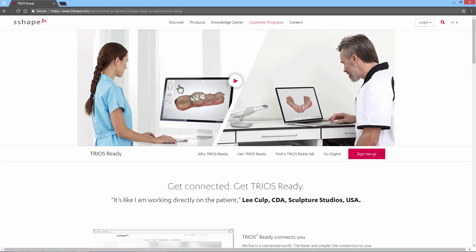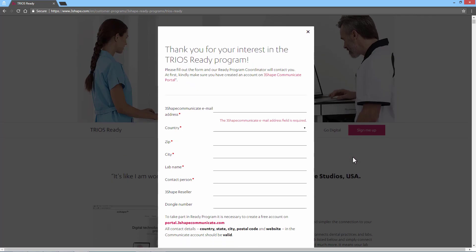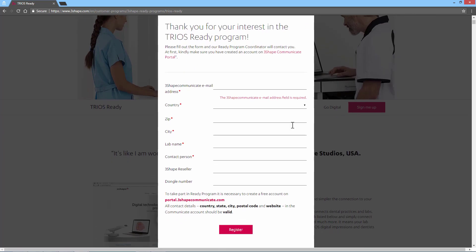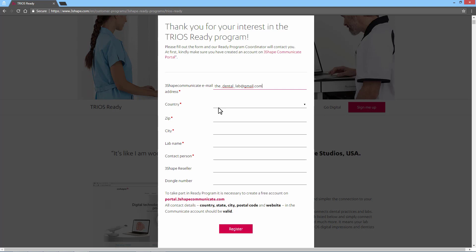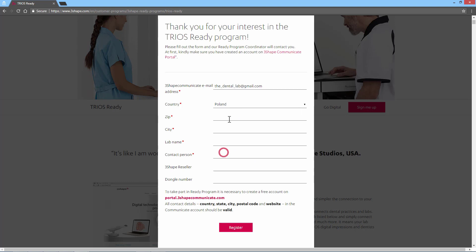To sign up for the TRIOS Ready program, click the Sign Me Up button. Then fill in all the necessary details. Please remember that you need to have an activated 3Shape Communicate account to sign up for the TRIOS Ready program. It is important that you register the correct email address, as this is the address that we will send your TRIOS test case to, and the email address 3Shape will promote to TRIOS users once you have completed the TRIOS Ready program.